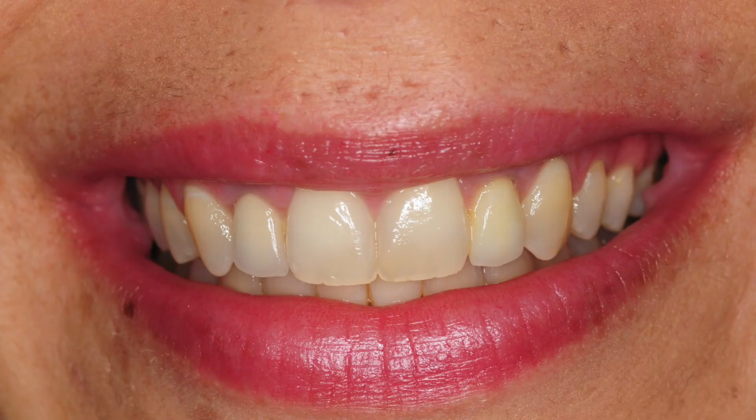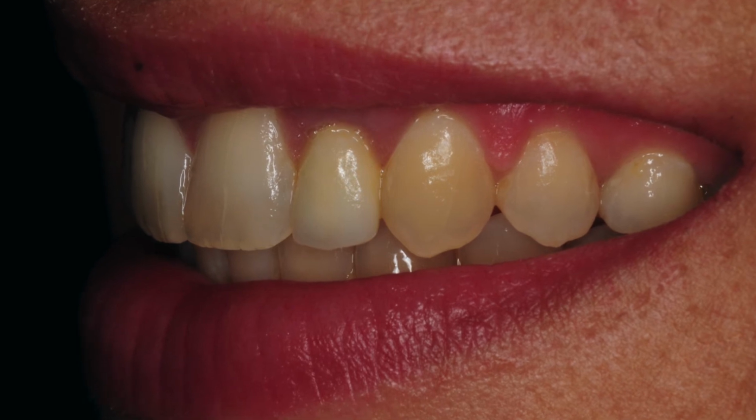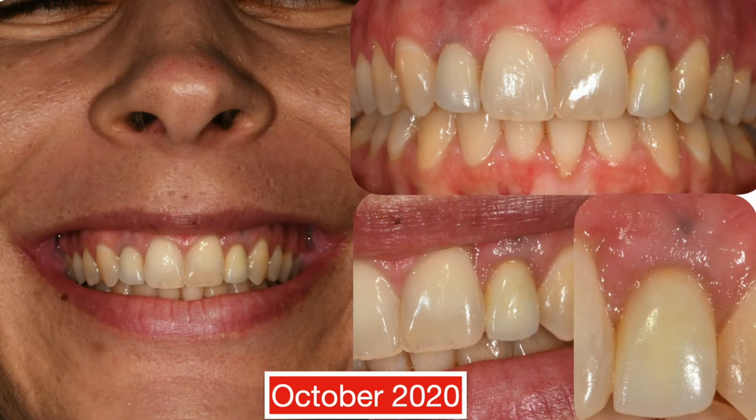So that's her beautiful, natural, normal, non-exaggerated smile. And on the Furhauser score, we're nearly at a 9. We have level gingival margins. That's from just last week in October 2020. And you could see the papilla is completely filled. We have a nice semi-lunar effect of the soft tissue. And then we have fullness of the soft tissue. We have stippling, we have good color, we have good root eminence. And that warmth of the tooth.